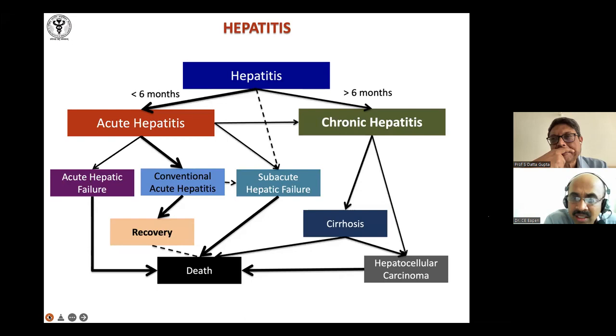Yeah, see, in chronic hepatitis, especially hepatitis C, it's a matter of chance how you get the yield. Nobody has found a way, even by doing a FibroScan or anything, to make out this area and that. It's a matter of chance, and that's why there is a minimum of 2 or 3 centimeters, and the more passes, up to 2 or 3, the more yield. I'll show you what people have found.